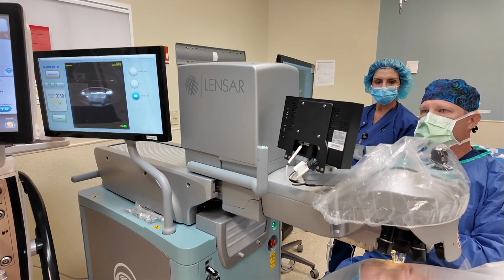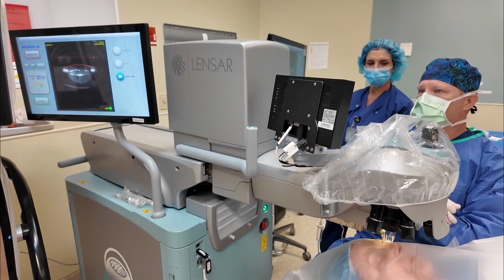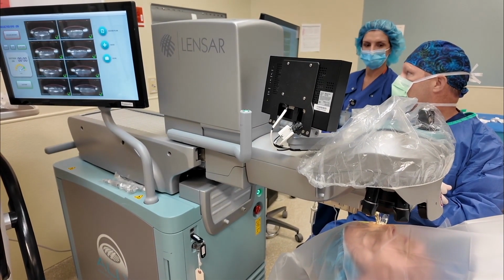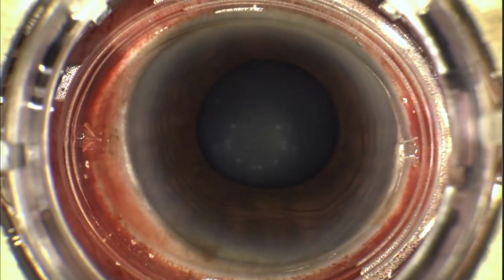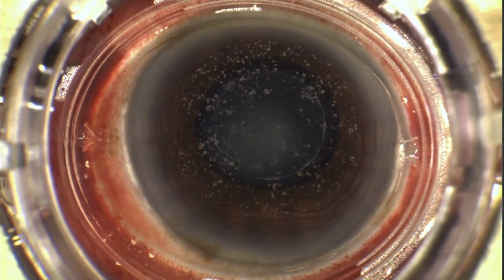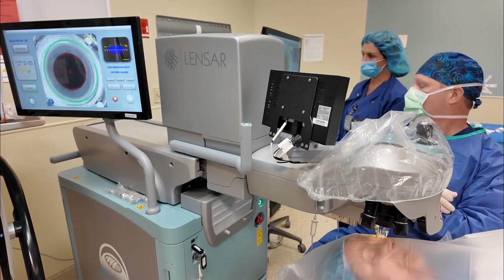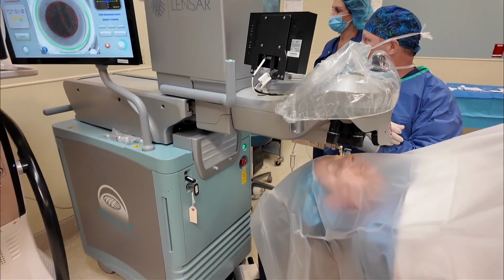This is just one of those cases where we're using the Ally laser, but the patient's already been scanned on the IOL Master, and that data went directly to the Ally. Now, after the docking procedure is complete, it will know the steep axis based on the keratometry of the IOL Master, and it makes little tick marks on the capsule. We call this IntelliAxis C, which can be really, really helpful when it comes to aligning the toric IOL. So it's not just for Callisto or for visualization under the microscope. It also can interface with other instruments.